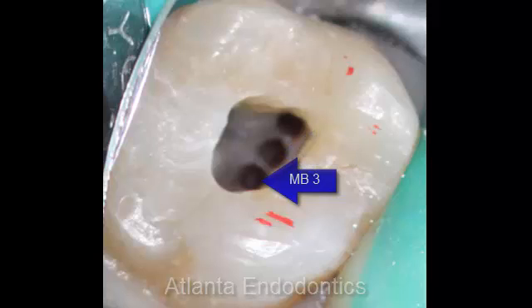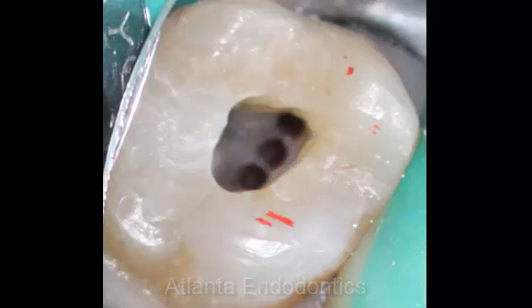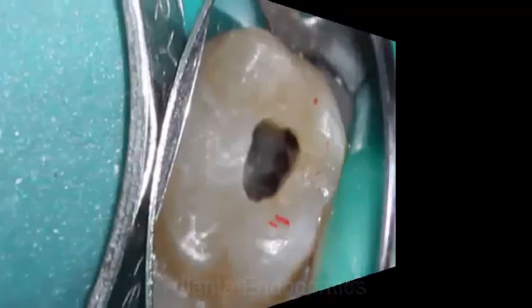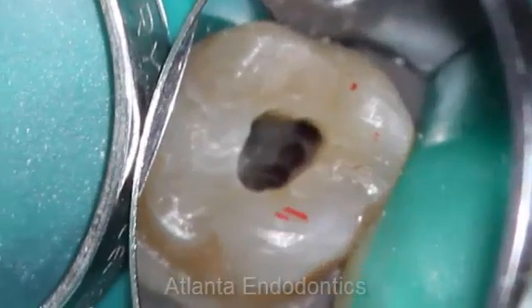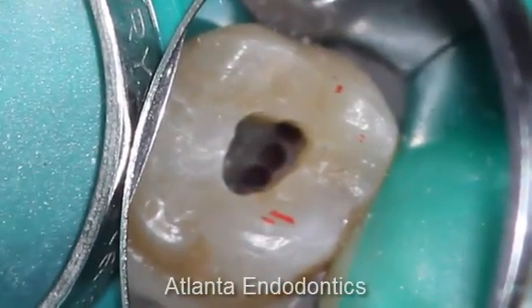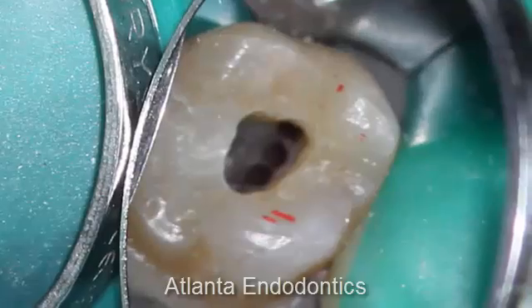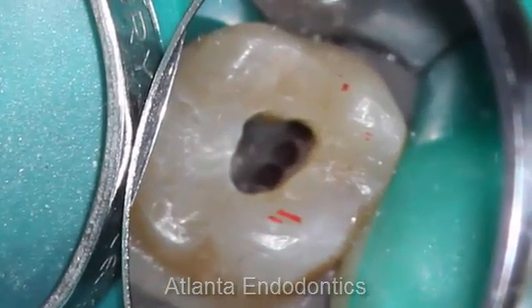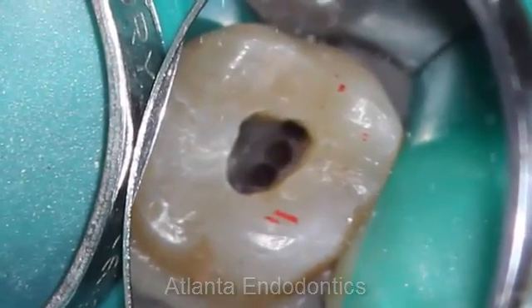Upper second molars have one of the widest variations in internal anatomy of all of the teeth. So having a microscope and being comfortable using the microscope certainly is an advantage to both you and the patient.